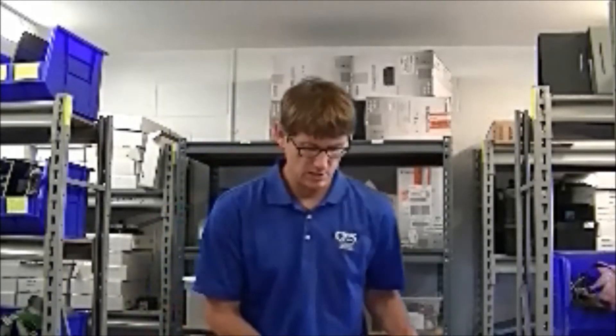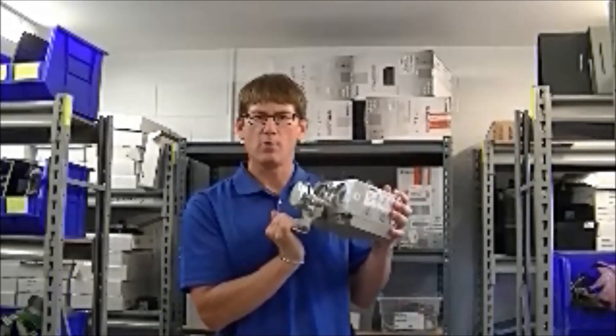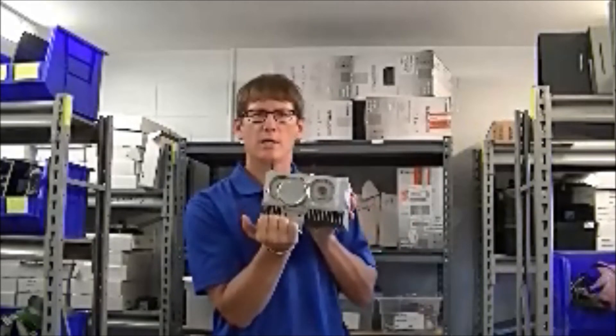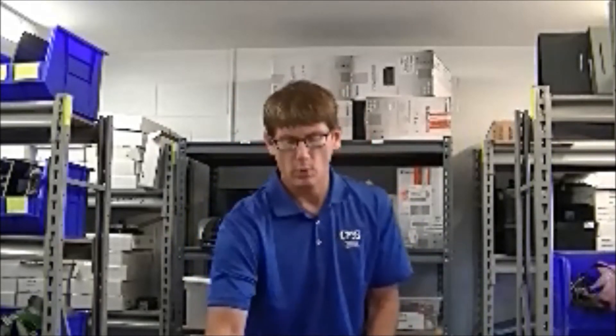With Complete Medical Services, the tube pad we have to offer is a brand new filter. As you can tell, it's beautifully cleaned, it's packaged professionally, and it comes with a complete documentation package.